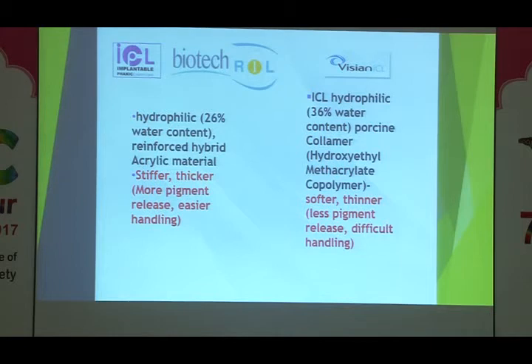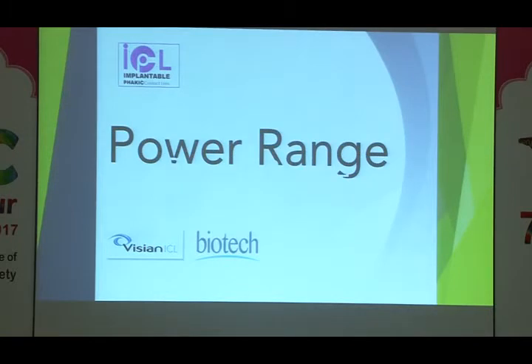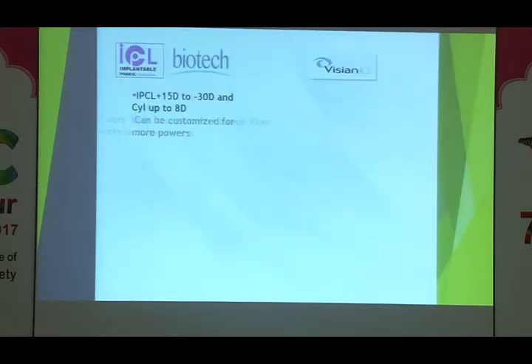Once the lens has gone down by 140, 150 microns at the end of 6 days, I have not seen it go down further. And I've got nearly 2.5 years plus experience, with 800 plus lenses now. The lenses are maintaining their position. Unless the patient develops a cataract with nuclear sclerosis and it starts swelling up, the ACD is not going anywhere, which I cannot say for the ICL. I've seen the ICL change its vault at a time decided, planned, programmed by the lens. I, as a surgeon, have no control over it. Another thing I was experiencing with the earlier lens was the central hole, but that's a different story by itself.